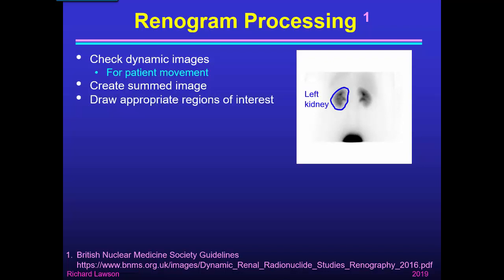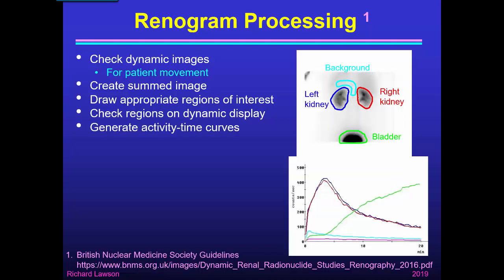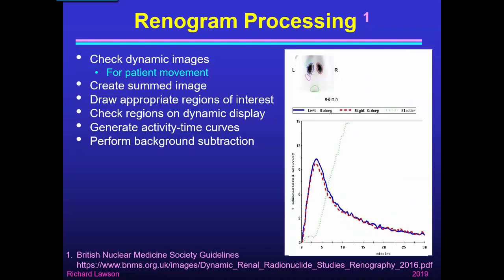We draw a region of interest around the left kidney in blue, around the right kidney in red, some background regions in a suitable place — and later in this talk I will discuss the different choices of background regions — and also around the bladder. We then check these regions on a dynamic display to ensure they encompass the correct kidney areas, that the kidneys stay within the kidney regions, the patient doesn't move, and the bladder stays within the bladder region. We then use those regions to generate activity-time curves and perform background subtraction from the kidney and bladder curves.